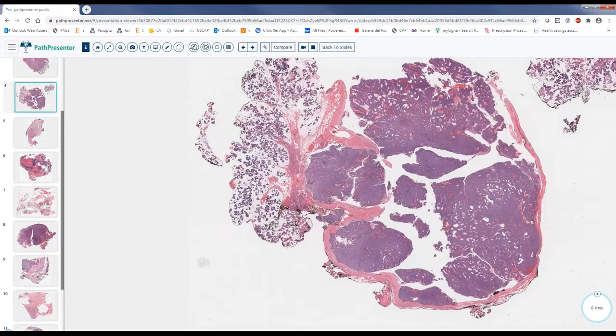Basal cell adenoma in salivary gland is basal cell adenoma. In skin, we call it, excellent, it is cylindroma, especially the membranous variant. So we have growth patterns: we have solid, we have trabecular, and we have membranous. Okay, membranous pattern is like a jigsaw puzzle, similar to cylindroma of the skin. Excellent. All right, so let's recap what we got here.